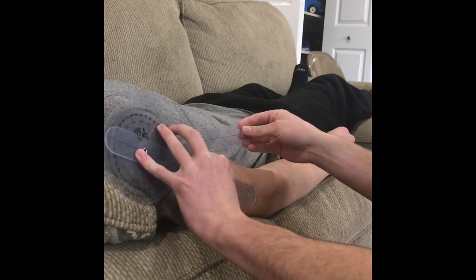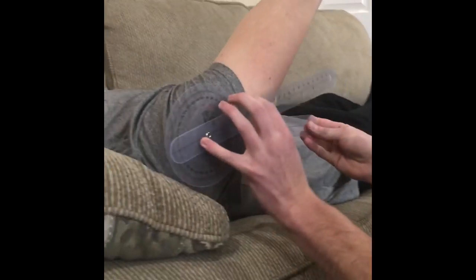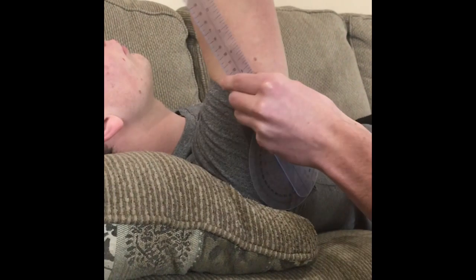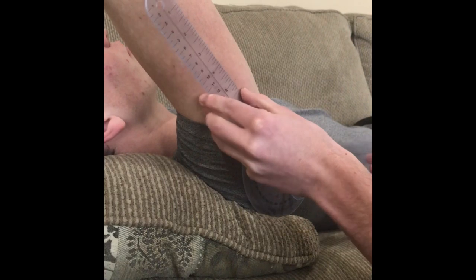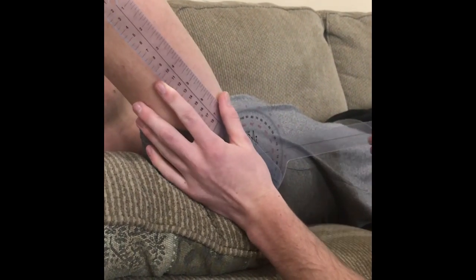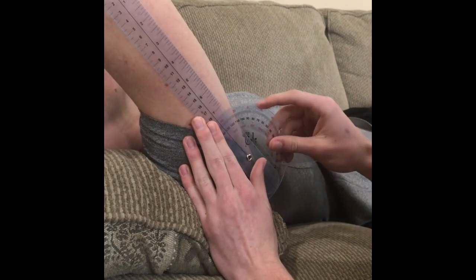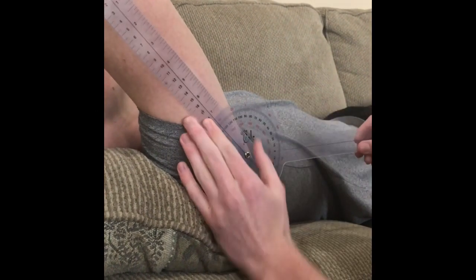So can you go ahead and flex your shoulder for me? Just bring your arm up. Keep going. All the way. Keep going, keep going, keep going, and stop. Right there. See, it's starting to engage his shoulder muscles a little bit. So then you would be able to use the stationary arm, measure it with your shoulder joint, and he has 135 degrees of flexion.